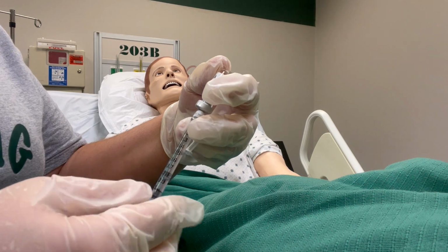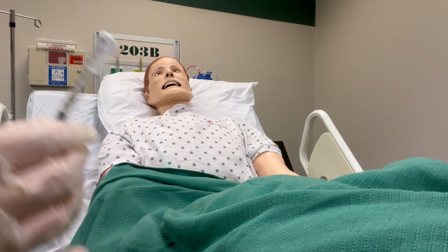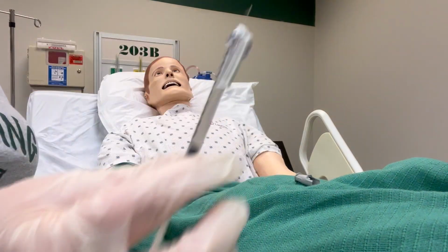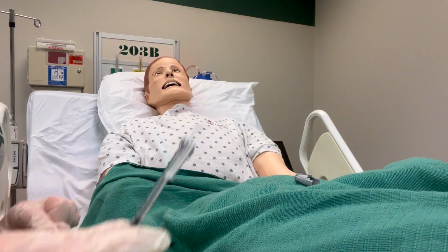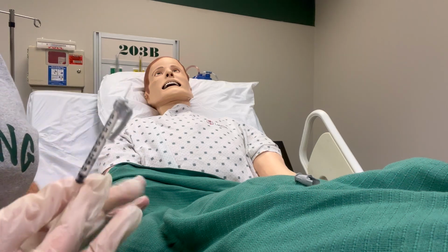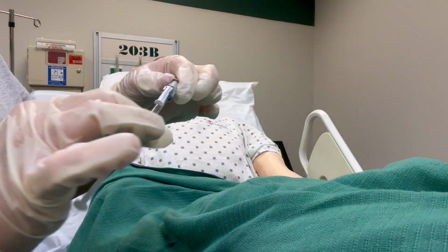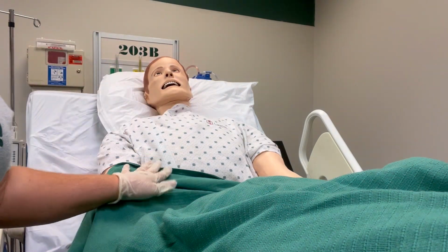All right, and so you can see I've got my 1 ml. So that's my 5,000 units of heparin. And remember, if you're going to put the cap back on, you can only do that for a needle that hasn't been used on a patient. So I am going to go ahead and do the scoop technique so that I can protect this needle while I'm getting Mr. Smith ready.